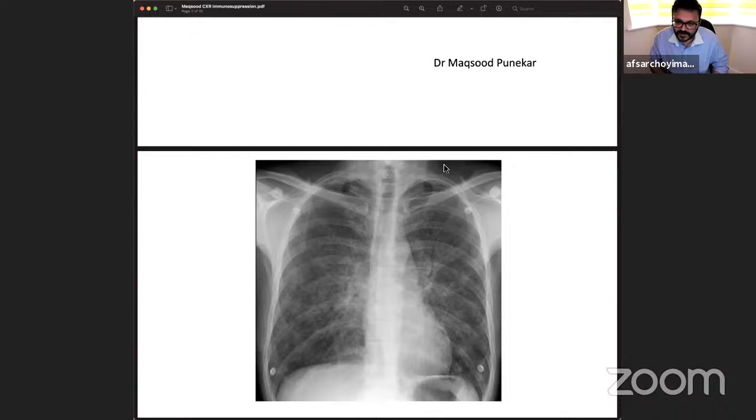But nowadays, people may not know, outside the UK the majority of X-rays are reported by radiographers. Quite a majority. Once they do the X-ray, they see the image, and if a lateral is indicated, most of the time they add a lateral straight away. That's happening in my department most of the time. Otherwise, bringing the patient back for a lateral X-ray, it's better to discuss whether it's really needed or whether you should go for the next test. It depends on what you're asking for.